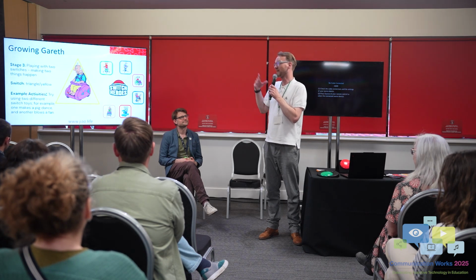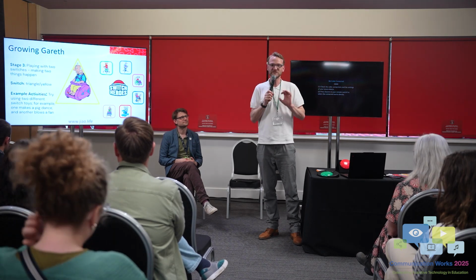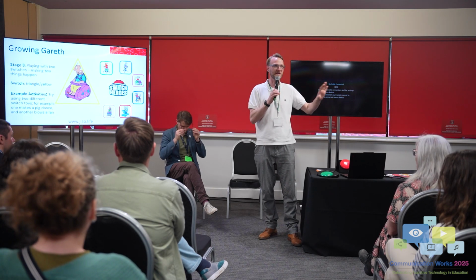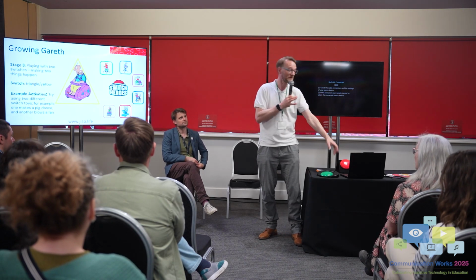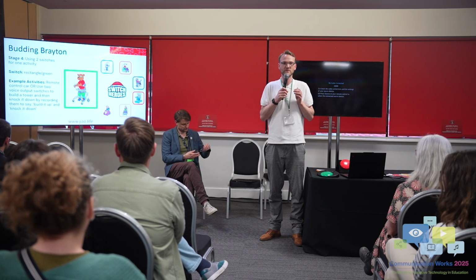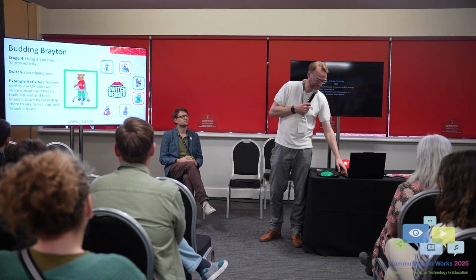And this is Growing Gareth, and this is where we start to introduce two switches. So we've got two switches that do two very different things. So this will start to teach choice. You press one, it does lights, another one it does vibration or sound, so they can differentiate between what's going on. There's two things now going on with my switches. And then once we've done that, we start to use two switches for one activity. So that can be like build it up, knock it down. They're just doing that one activity but using two switches for it.